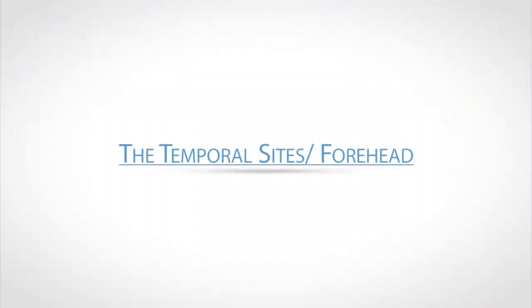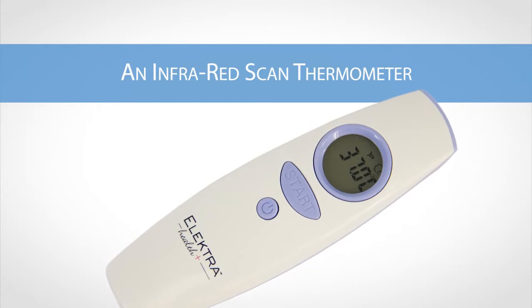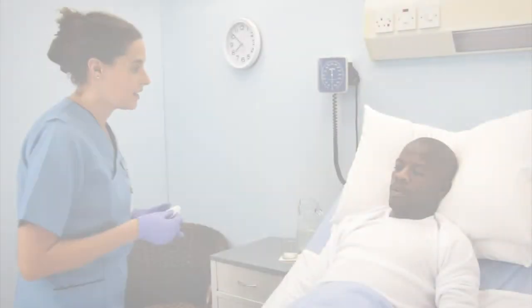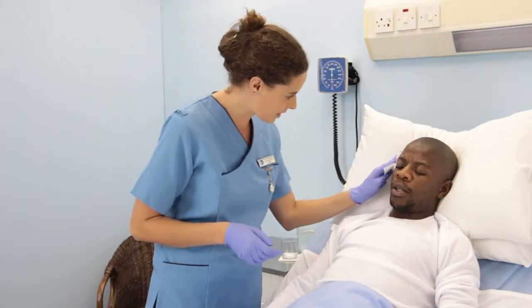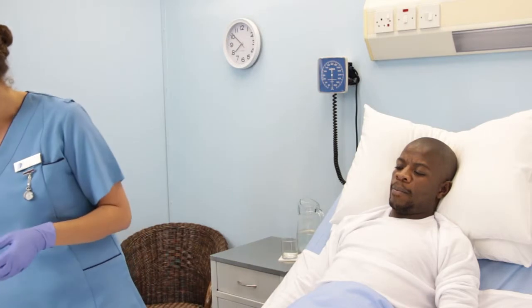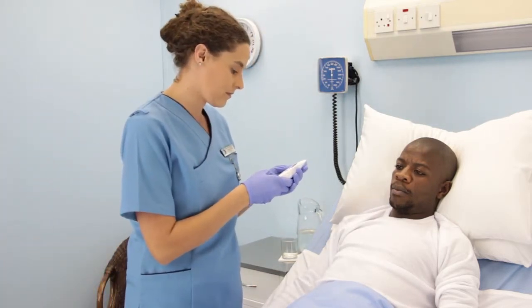The temporal sites or forehead. In this demonstration, we will make use of an infrared scan thermometer. Ensure that the selected skin area is dry and moisture-free. Switch the thermometer on and wait for the indications that the device is ready for use.